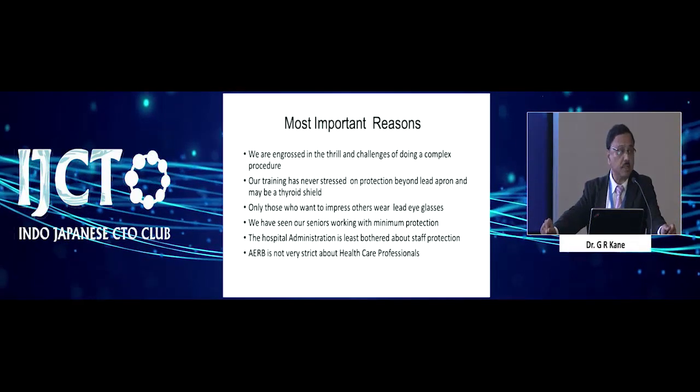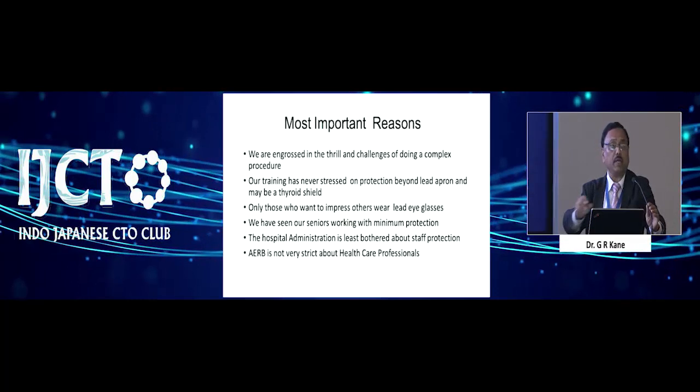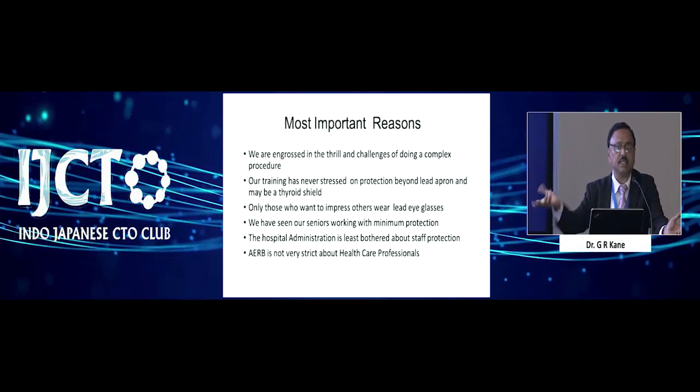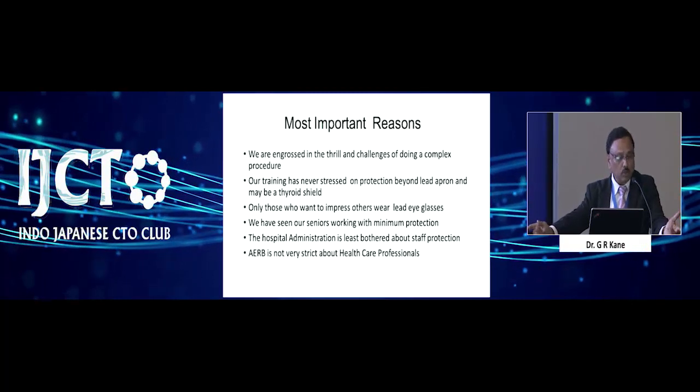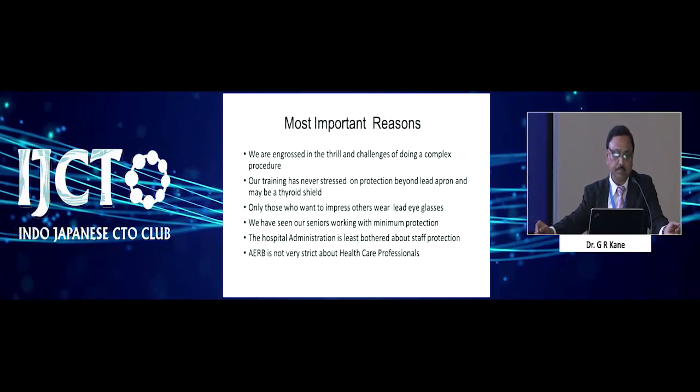It's also possible, and I'm sure about it, that the hospital administration is not bothered, because I have found at many places some of the lead shields are missing, the upper one or the lower one. You ask the technician, they say it did not come with the machine. Then you talk to the administration, they say no, we'll purchase it. Four or five years have gone by, and that thing has never come.